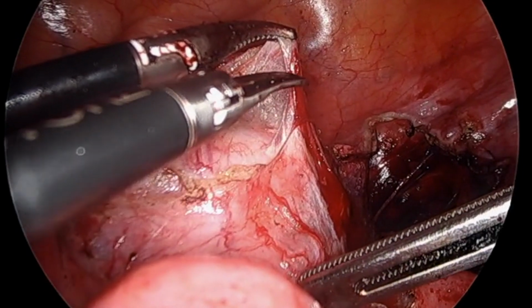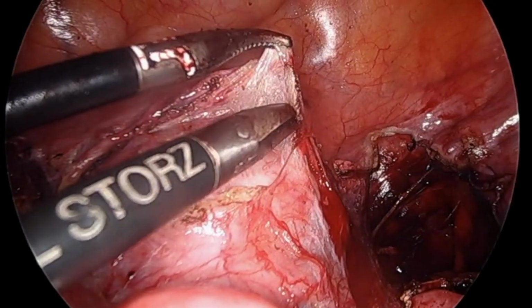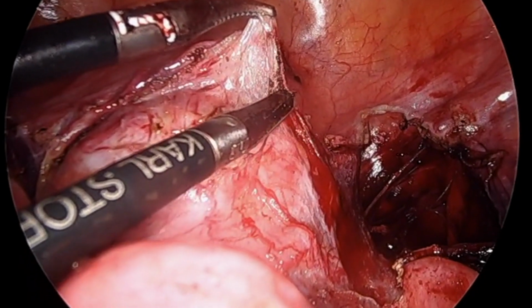Now here we see a larger area of bleeding along the bladder peritoneum. This time the scissors make direct contact with the tissue, utilizing a desiccative technique for hemostasis.